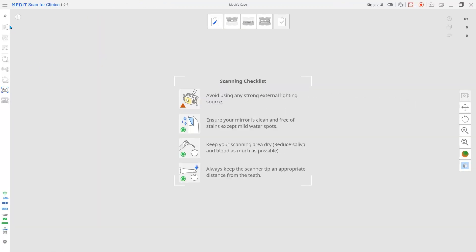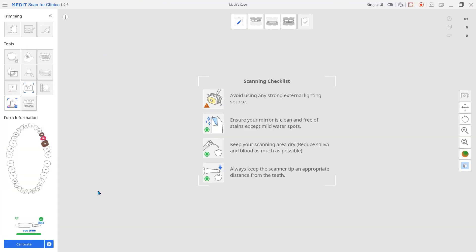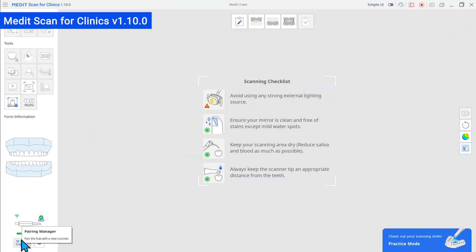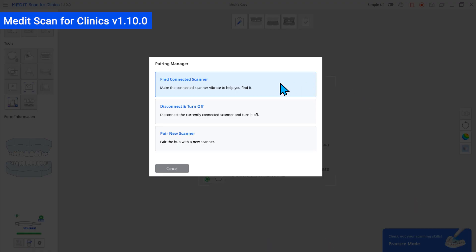The next new feature is the pairing manager. With it, you can easily and conveniently manage connections between multiple scanners and hubs.